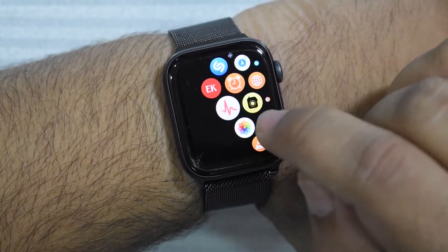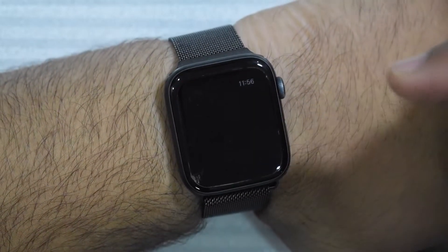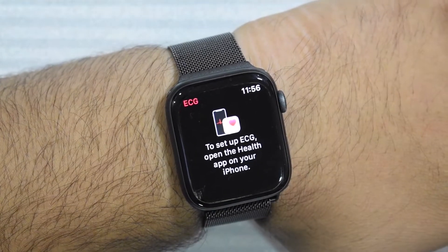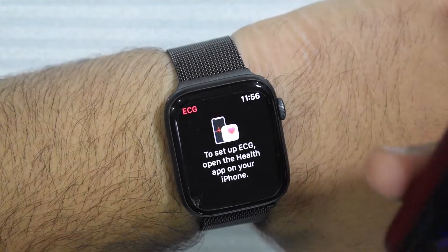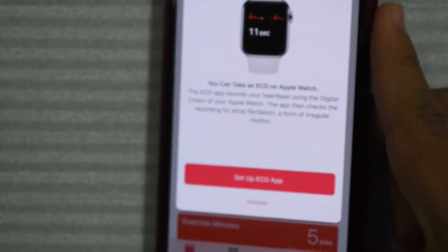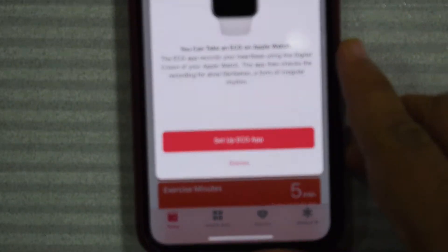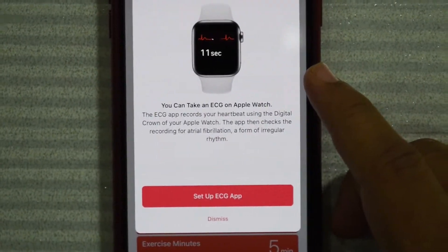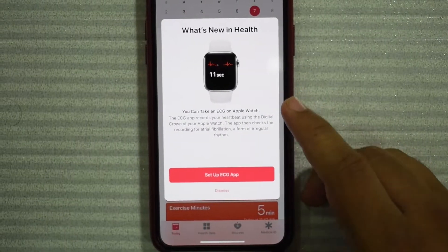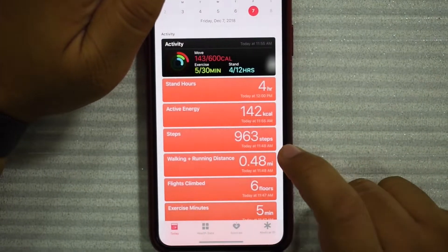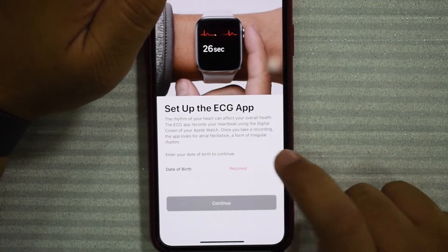Here's that new app. You don't want to click on it directly. To set up an ECG, open the Health app on your phone. Let me open up the Health app. Set up ECG app — set up now.